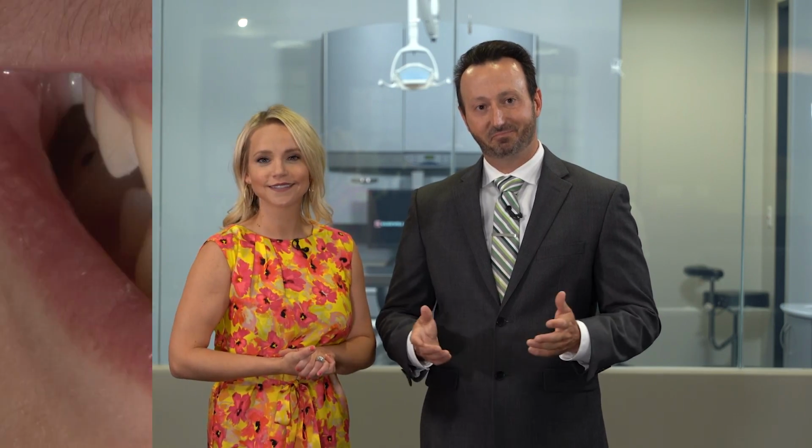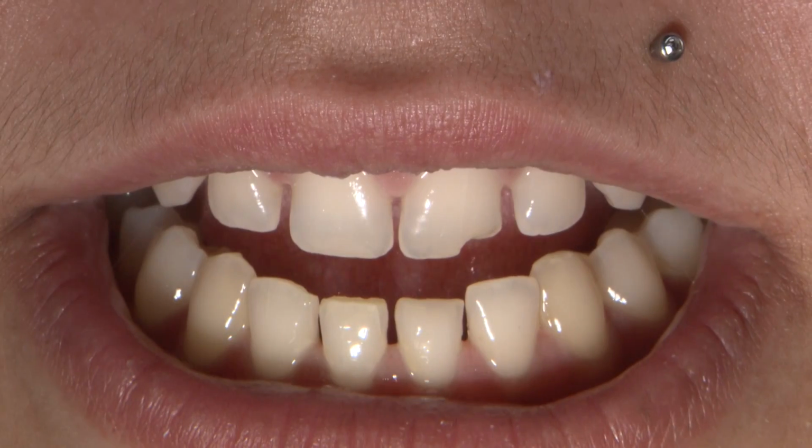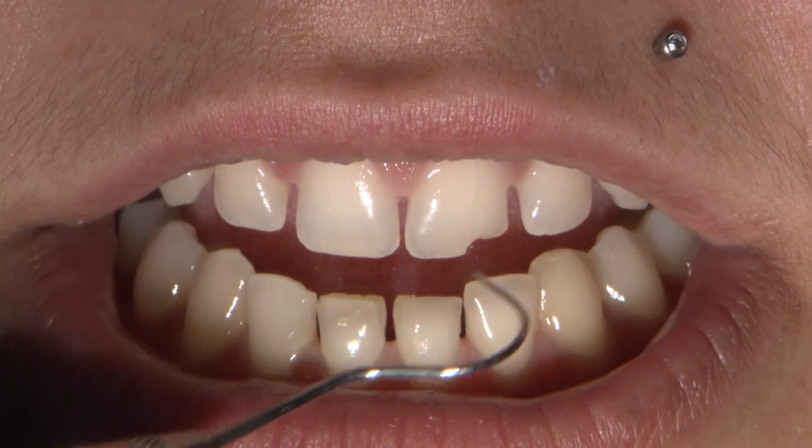Well, I tell you what, in Dr. Muresan's own words, lasing is amazing when you have gummy smiles for miles. That's exactly what we're talking about today. Dr. Muresan is going to change the gingival height using a series of gingivectomy procedures over time and allowing them to heal. Well, let's see how this works. Let's check it out. Dr. Muresan? Welcome back. Let's dive right in where we left off from the last episode and continue with the treatment.